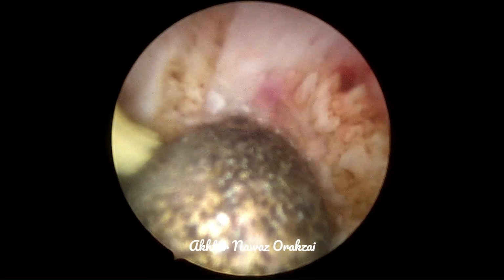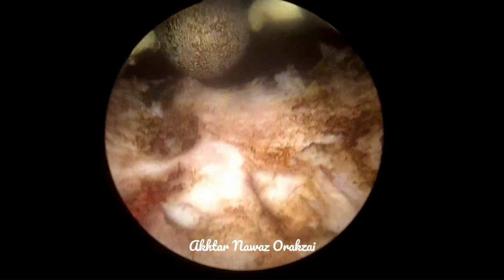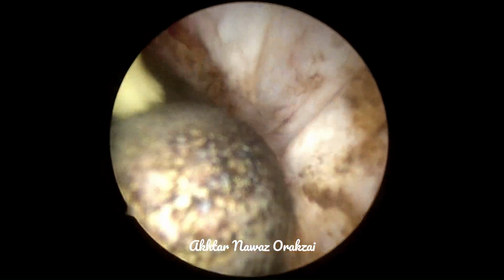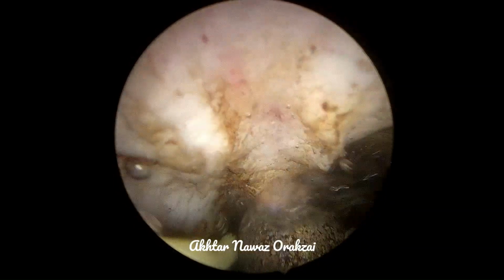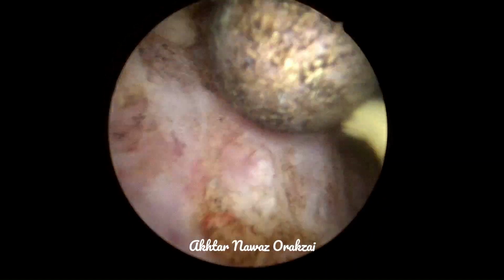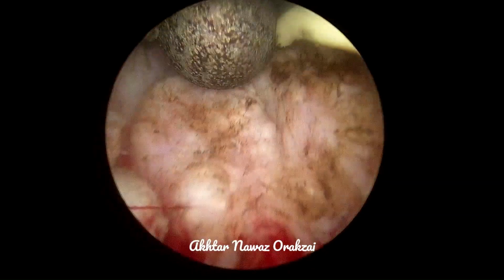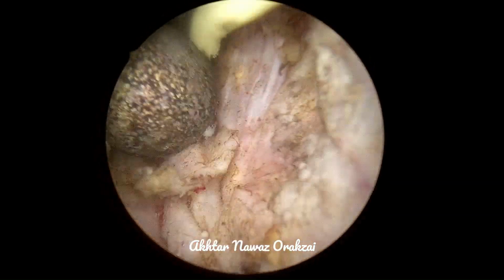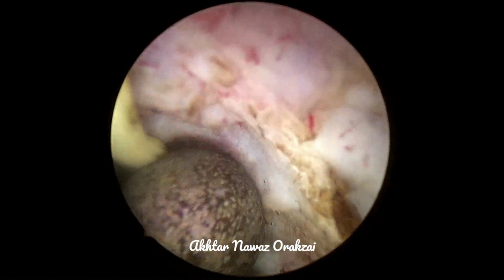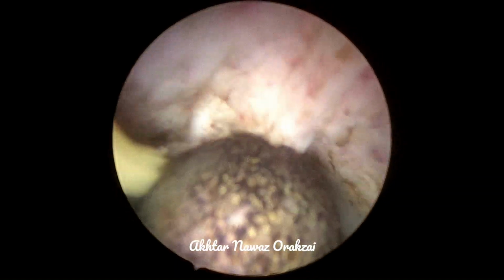Here I am trying to avoid coagulation of the cavity in the capsule which was opened, and I am trying to coagulate the edges of that opening, because if I try to coagulate the center of that opening, this will lead to an increase in the size of that area, and it may open up more vessels, which then will not be able to be controlled.